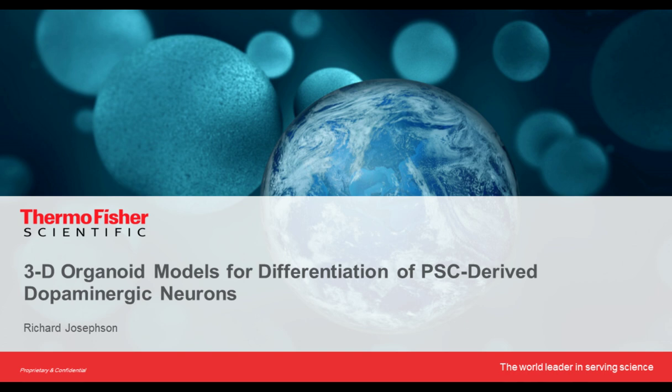Can this system produce organoids at a large scale? So the system as we have it produces organoids at what I'm going to call medium throughput. The throughput is certainly higher than if you are encapsulating organoids, which is very labor intensive, but it's not as high throughput as if you were going directly from the PSC suspension culture through bulk specification of spheroids into organoids. So we would like it to get to be high throughput, but we're working on that.